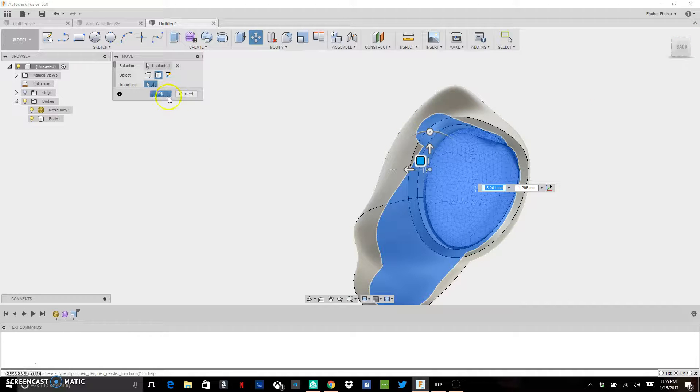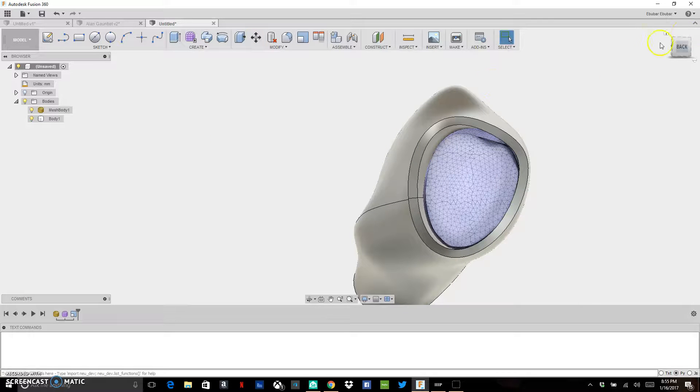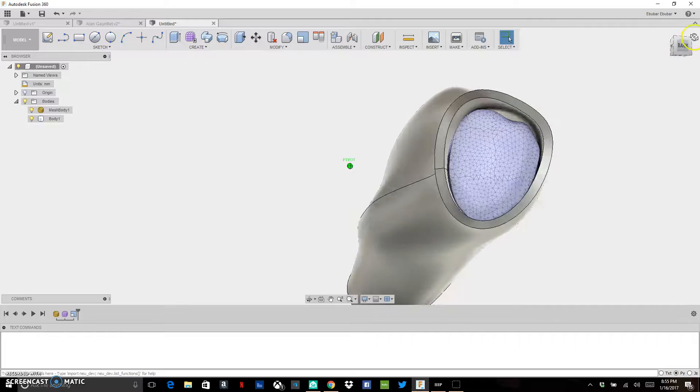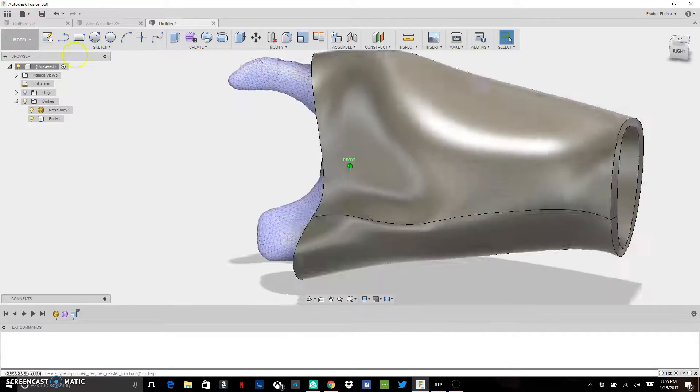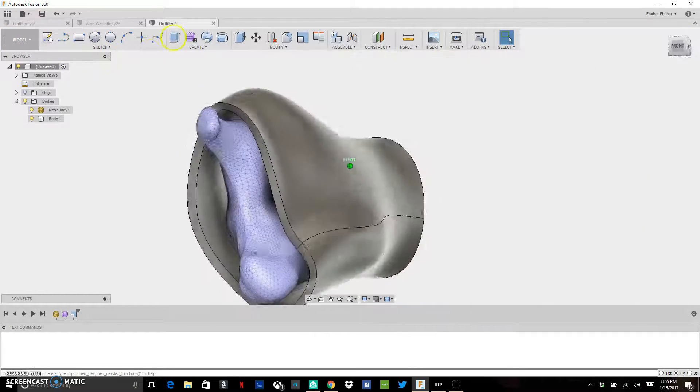A lot of the places where you see space, that's where you could put in some padding to make it a little bit more comfortable.